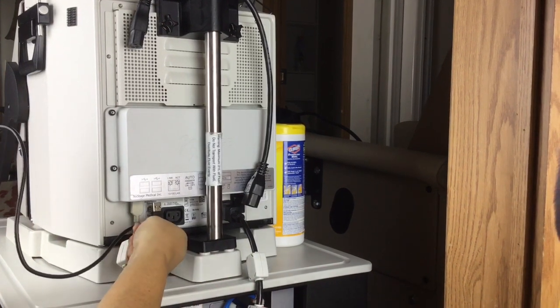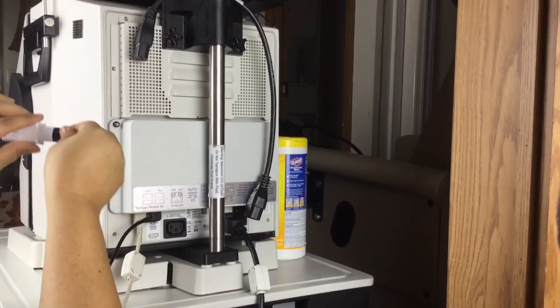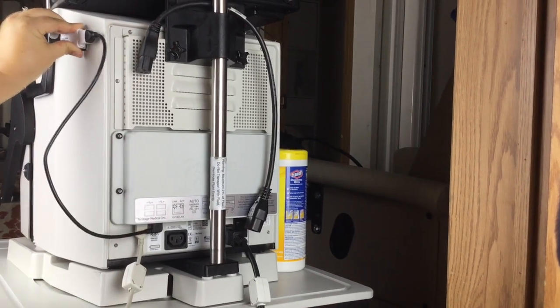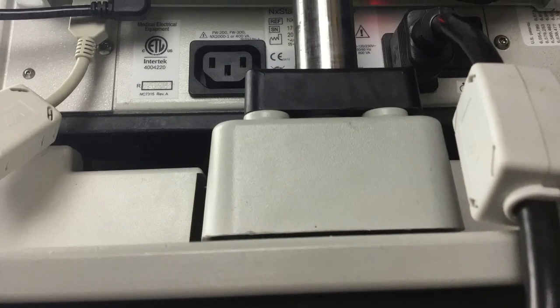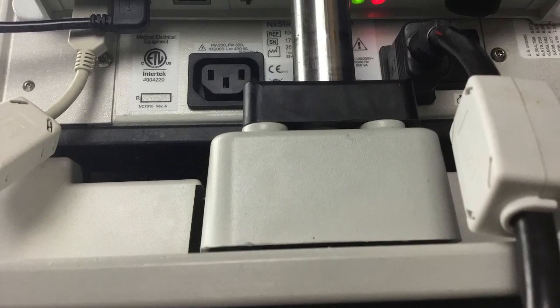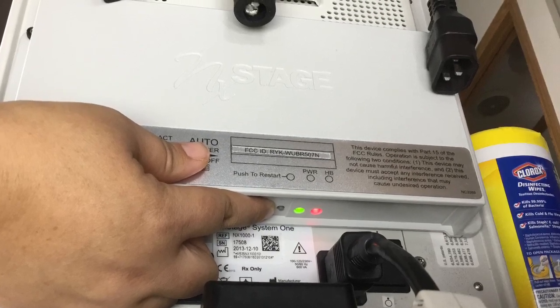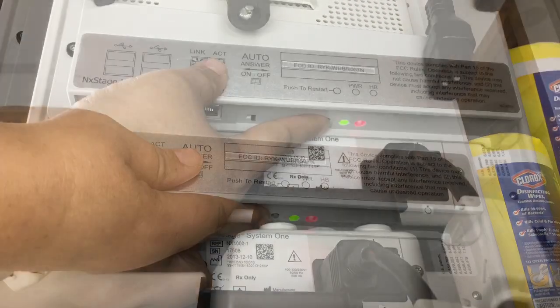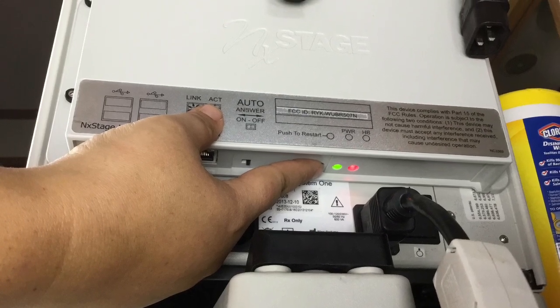Connect the USB Wi-Fi adapter to one of the USB ports on the underside of the Connex box. Now remove the protective film from the back of the Wi-Fi adapter and attach it to the side of the cycler without the filter holder. Do not place it further forward than the handle. Press and immediately release the push-to-restart button on the Connex box. Wait for the Wi-Fi adapter to complete its start up. Congratulations, you are done!